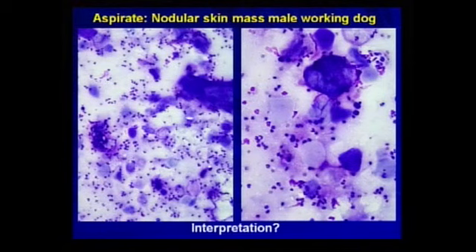Okay, cholesterol crystals lead us to believe that we are looking at a keratin-producing cyst or neoplasm. It could be an infundibular cyst, as we just saw. It could be a follicular neoplasm, such as an infundibular keratinizing acanthoma, which is probably the most common, a trichoepithelioma or trichofolliculoma, or because of the neutrophils, we could even be dealing with a squamous cell carcinoma.